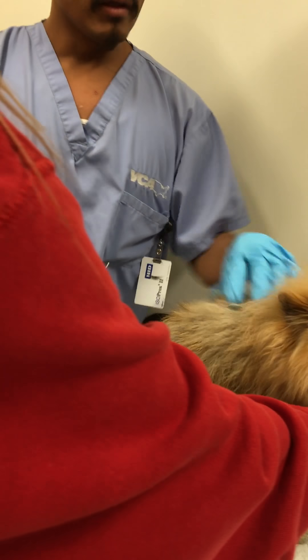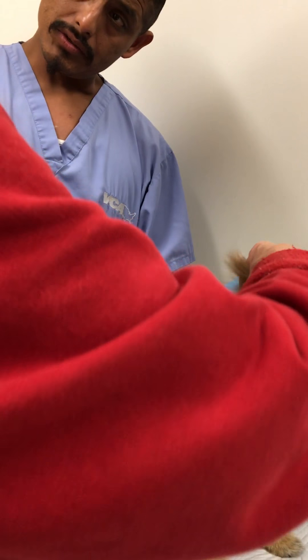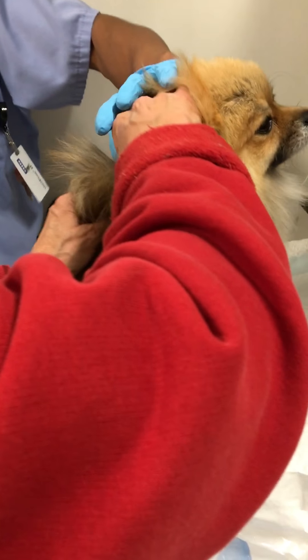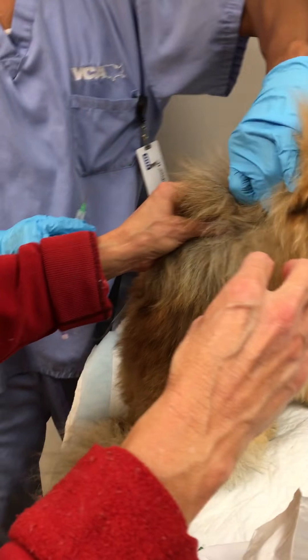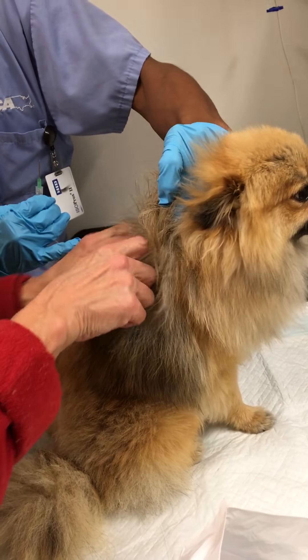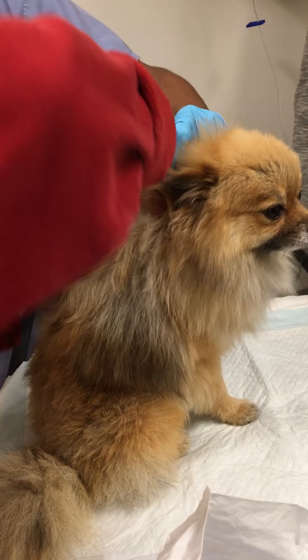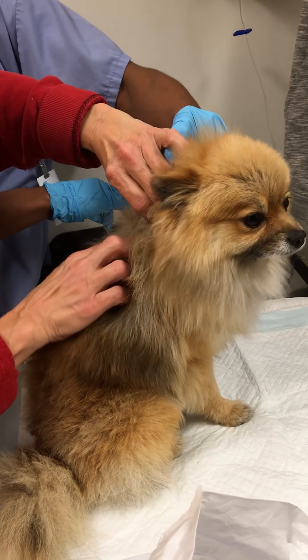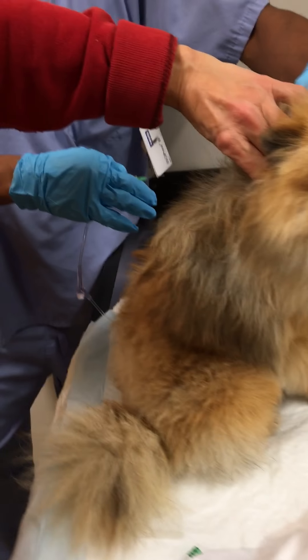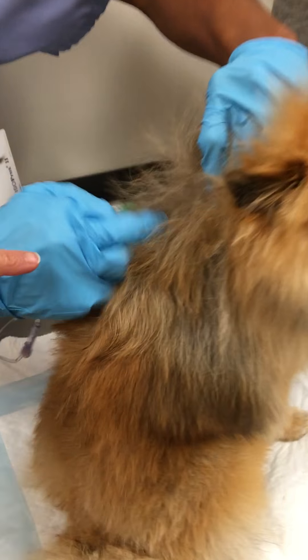So next, this is the painful part. Don't worry if you go through the skin or you start seeing leakage, okay? That happens. Just trying to find a tent because he's very dehydrated. When they're dehydrated, there's more skin. He's not so dehydrated. Feel what I'm doing right here. See that? Feel how my fingers are. You see all the skin? We're going to go deep, but not too deep that we're going to go in the muscle, okay? Watch me do this. Go in the skin.